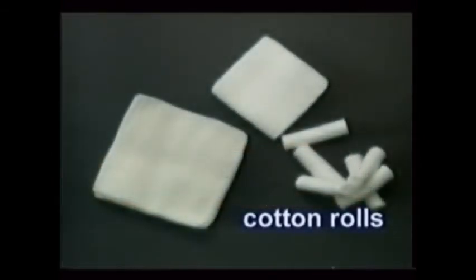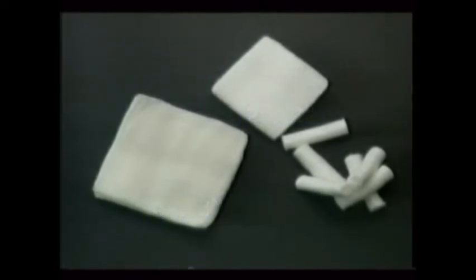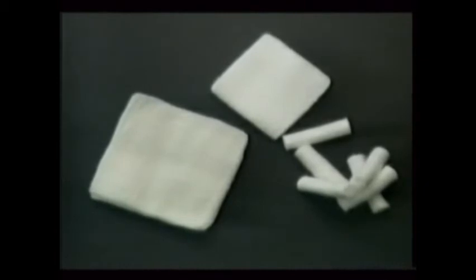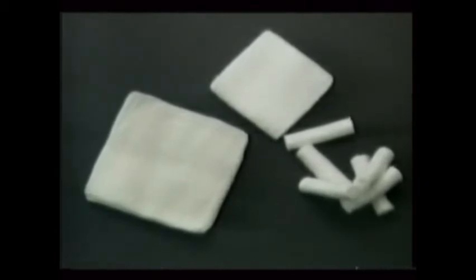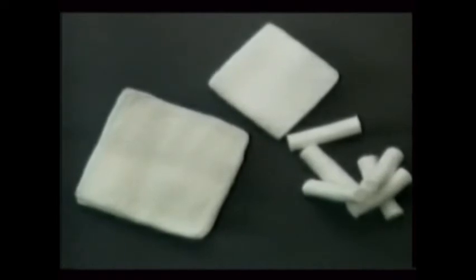Cotton rolls and cotton gauze, 2x2s, help keep the treatment area dry, along with adequate suction, of course. It's best to have on hand as much as you anticipate using, and even a little more, so you don't have to leave the room for more during the patient's procedure.